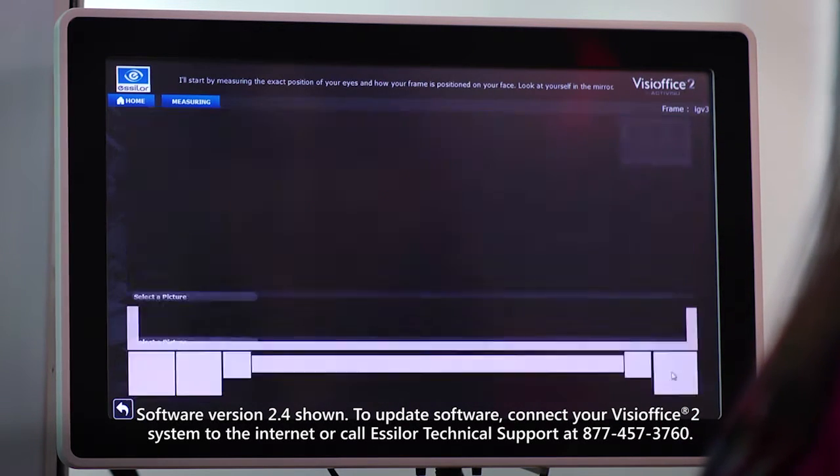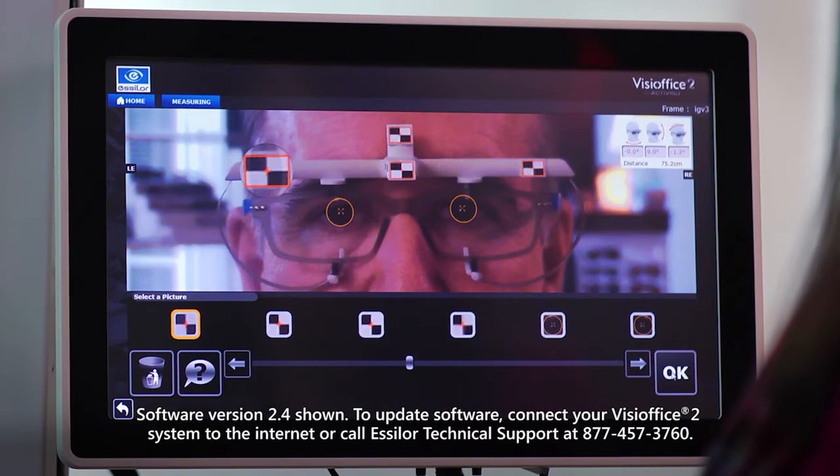The screen will show it's recording when you select the icon. It will stop and move to the next screen when completed.